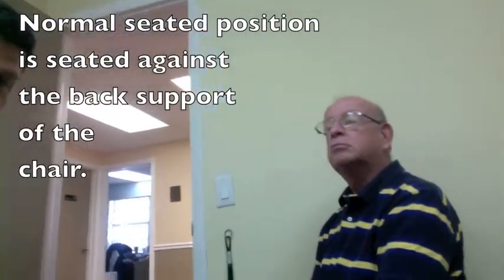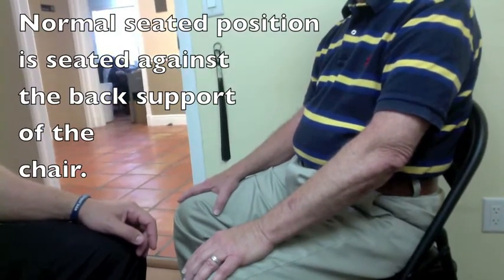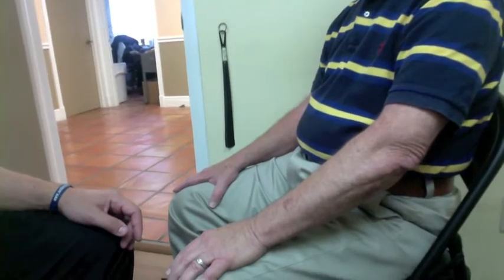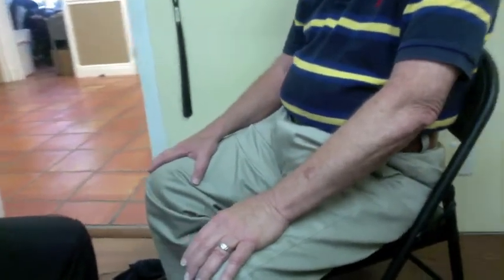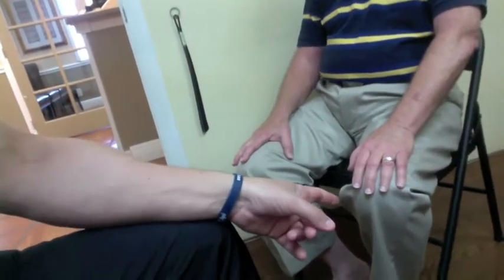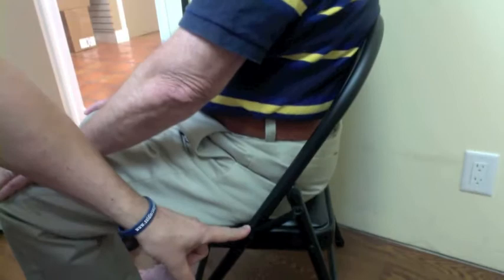The first step is actually getting into the chair in the right position. It makes a difference — don't take it lightly. What we're going to show you here is that Dr. Mallon is seated in the chair like anybody would, which is not the position we want. So I'm going to show you that he is seated far back. We want the hip joint to be at 90 degrees, so he's seated all the way back.